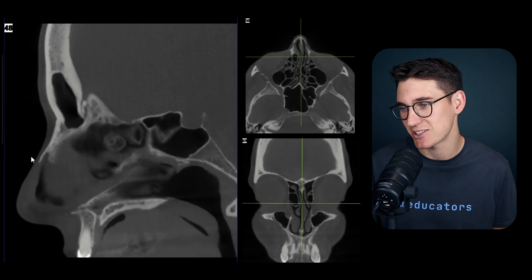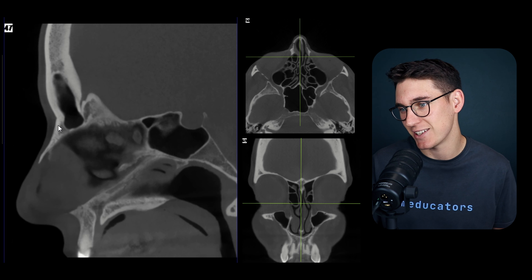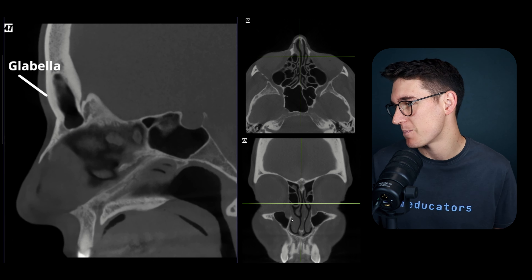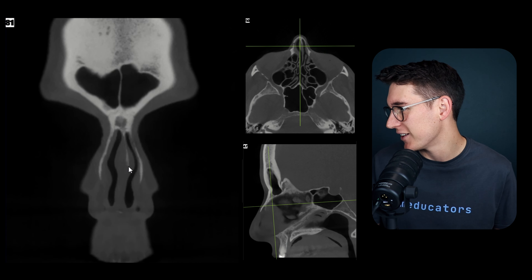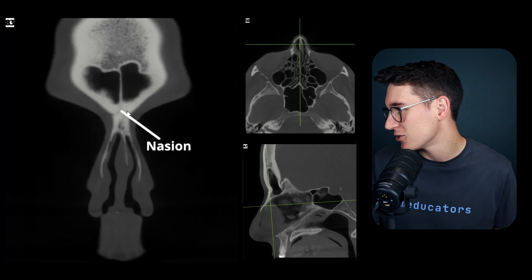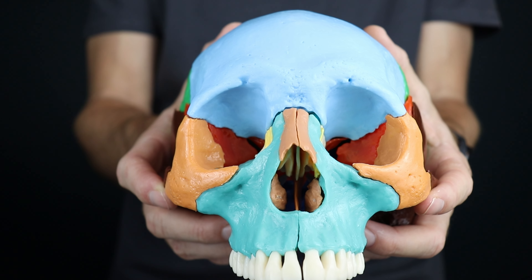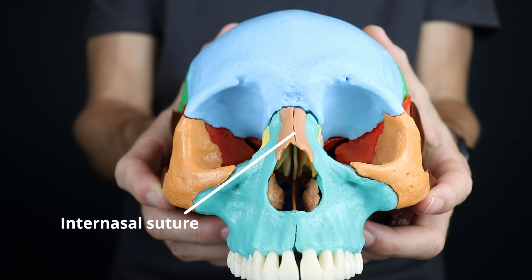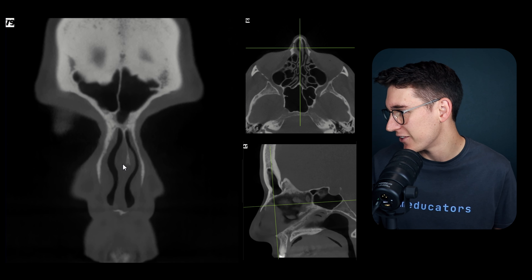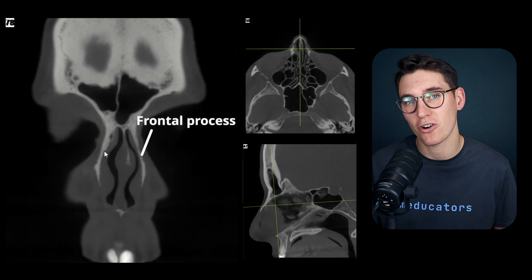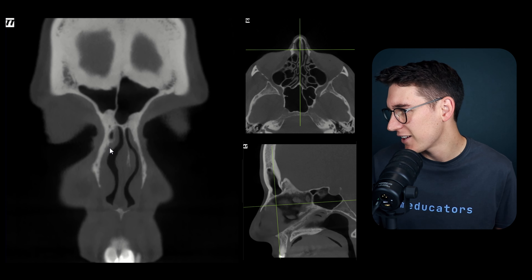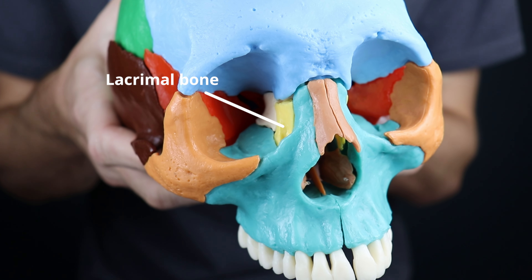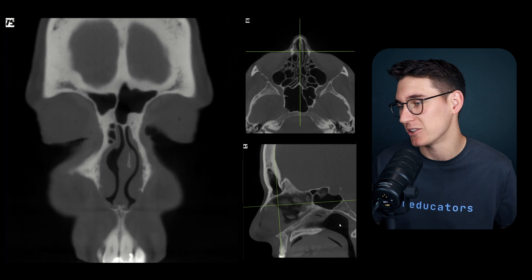On the sagittal slice we can see the nasal bones extending to the nasion, with the glabella lying superiorly above the nasal bones. On our coronal slice, the nasion is where the frontal bone meets the nasal bones at the midline. The nasal bones are separated by the internasal suture. As we head posteriorly we encounter the frontal processes of the maxilla, and further posteriorly is the lacrimal bone, which we'll look at when we examine the nasolacrimal duct.